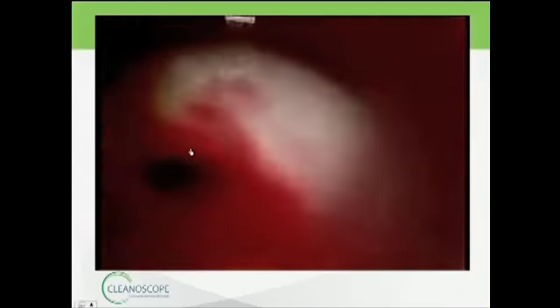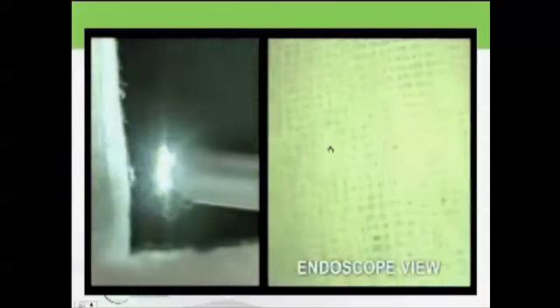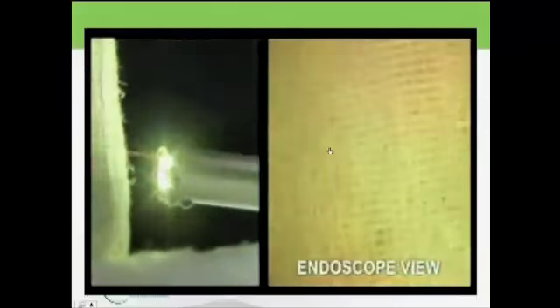What you're going to see on the left is the scope. It's a 5mm scope with the overtube on it. On the right is the image of the sponge the scope is looking at. And what's put on the end of this now is a betadine type of fluid. Wrong way. Can I go back? Stop for a sec. Go back to the other slide. Okay, so we see it spray, and look on the right. It just continues. It stays clear. And that happens to be a betadine solution, but it's true with blood as well.